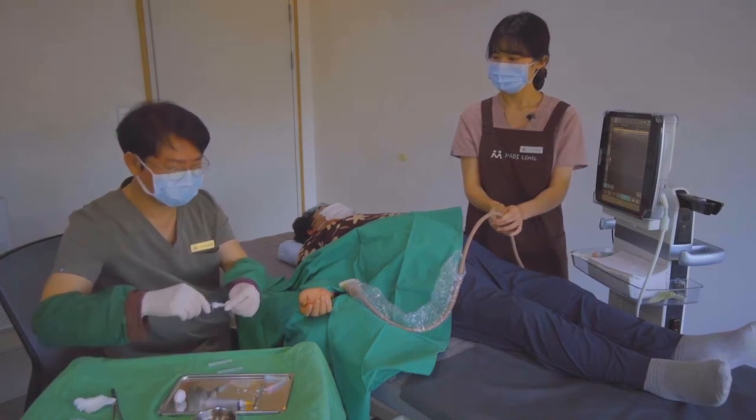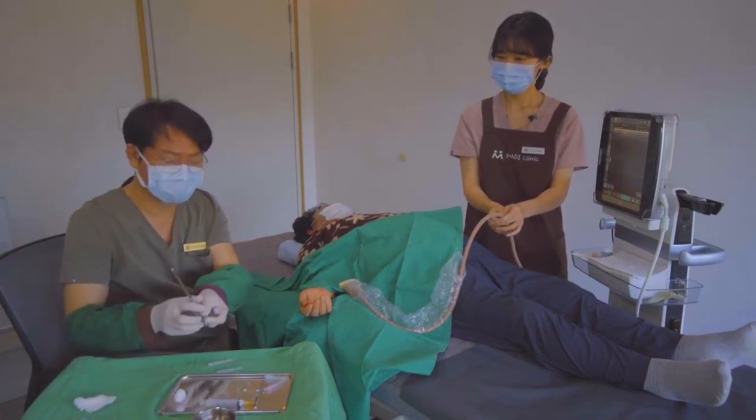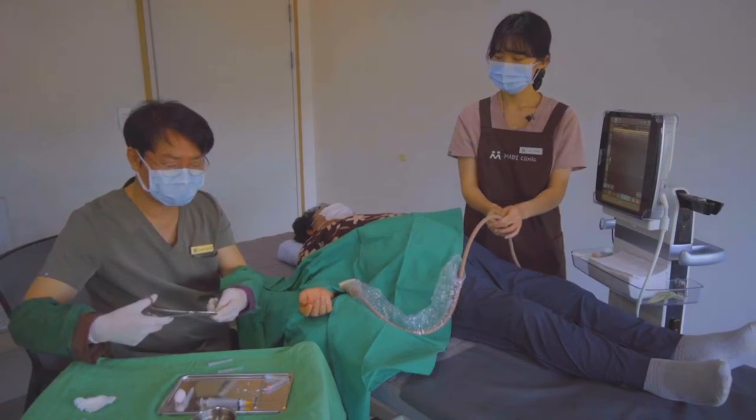Next, I will connect the syringe to the 18 gauge needle. I've bent the needle tip to use the blade to release the scar tissue.